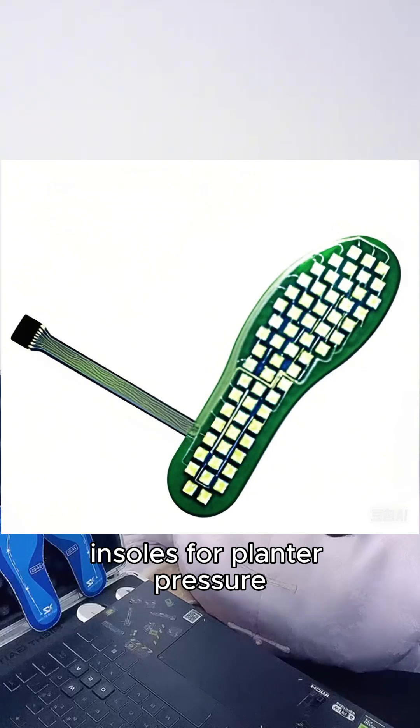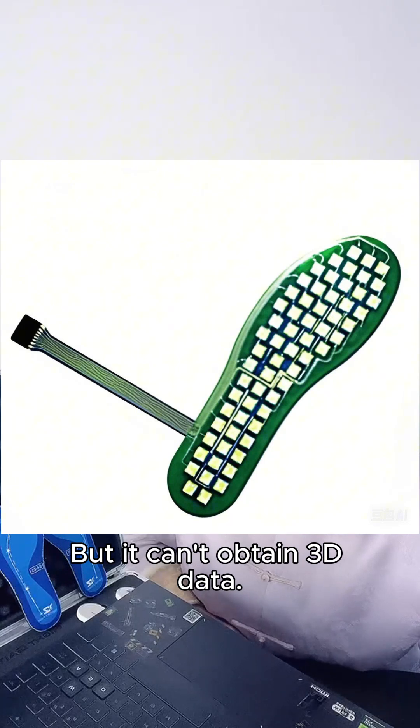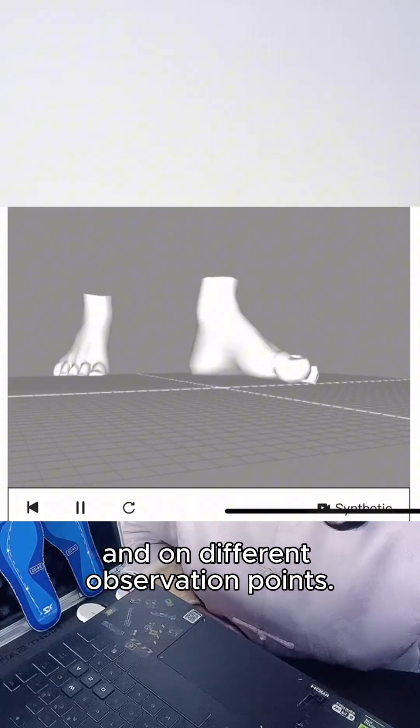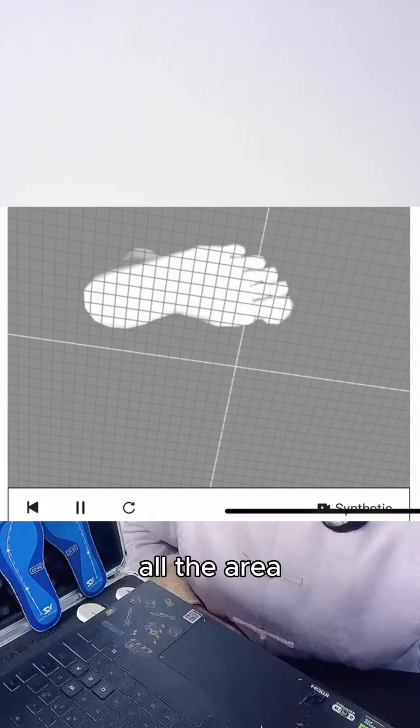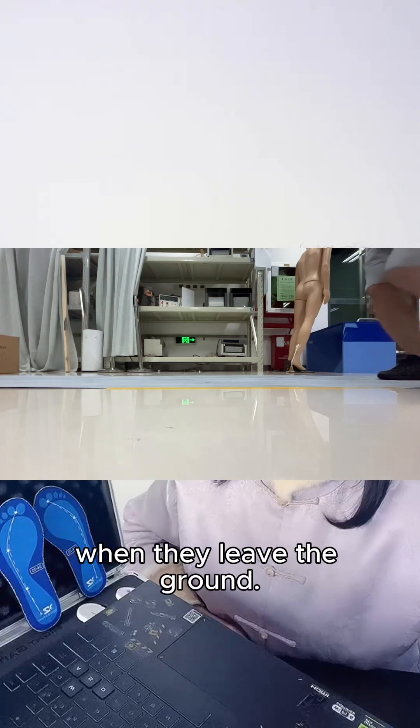The gait measurement method using thin film insoles for plantar pressure can measure the static and dynamic pressure of the sole, but it can't obtain 3D data. You can't know the angles in different gait cycles and at different observation points, or the postures and heights of the toes and heels when they leave the ground.